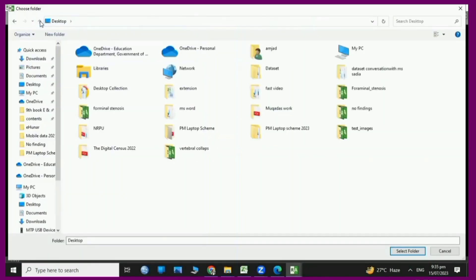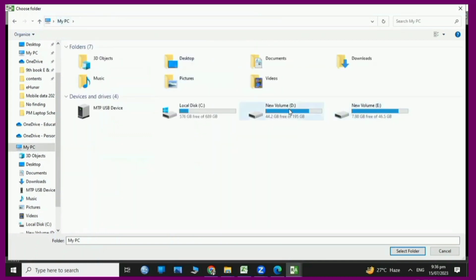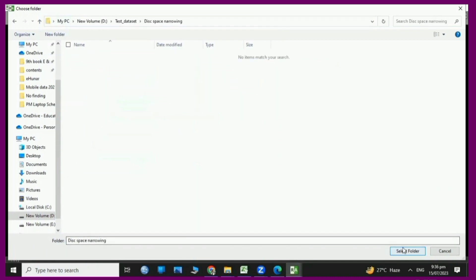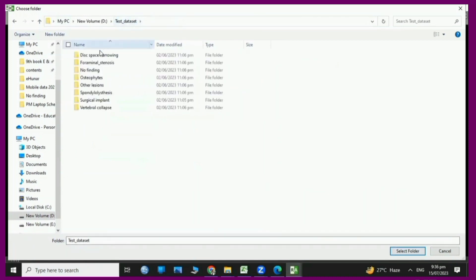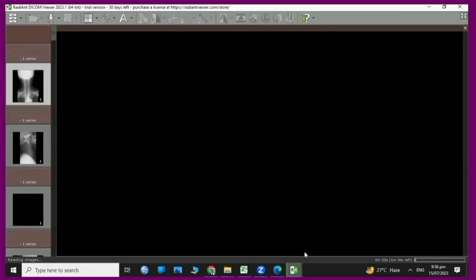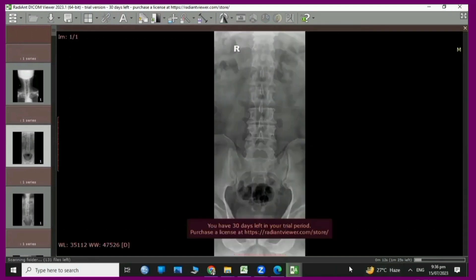I open the address and open the folder. One thing I want to tell you: it does not open just one image — it opens the whole folder as a sequence. As you can see, it shows the image at full strength. It also stores the patient name, patient ID, patient gender, doctor details, and image coordinates, etc.